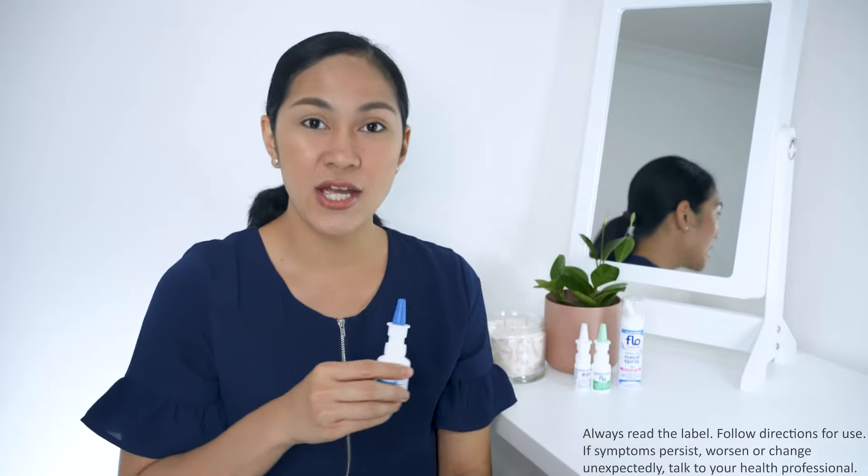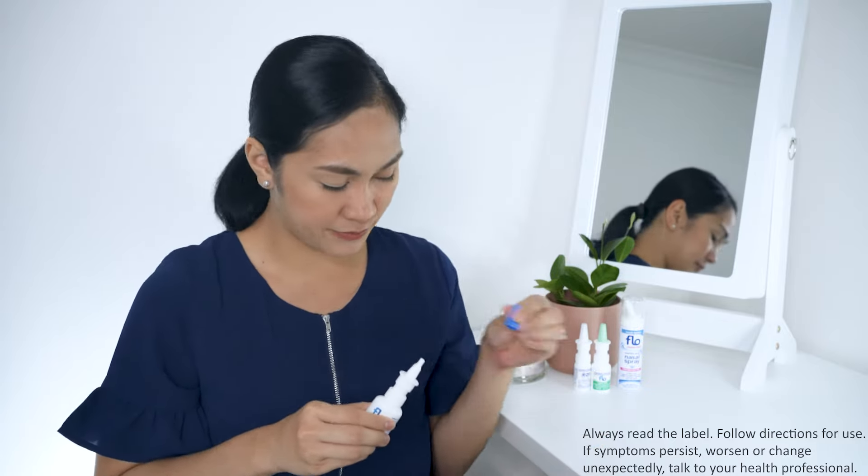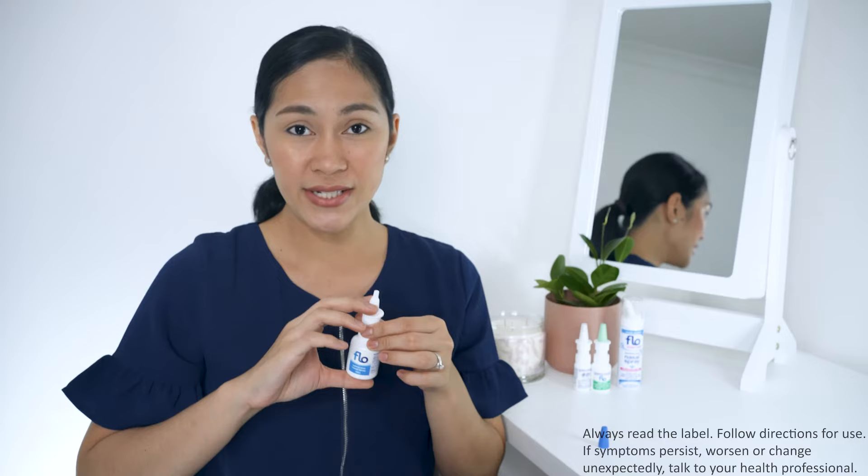Get your nasal spray. Remove the dust cap. Point the nozzle away from the midline of your nose towards an angle to the outer ear.